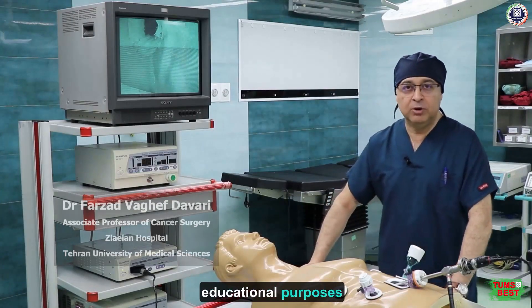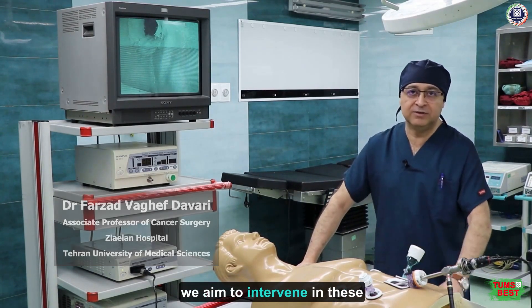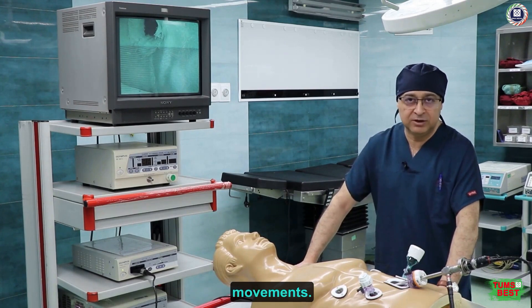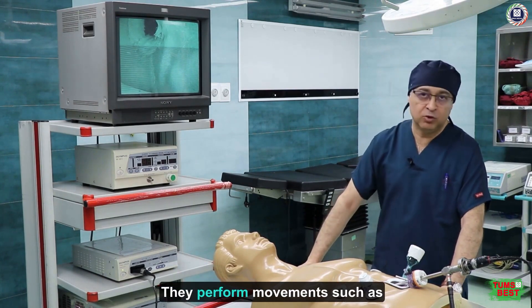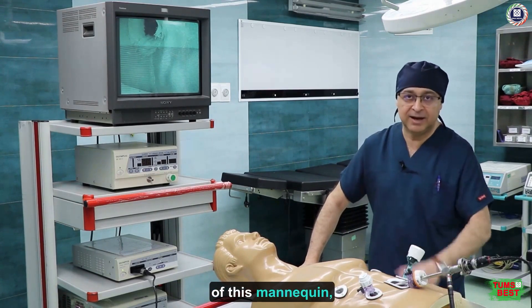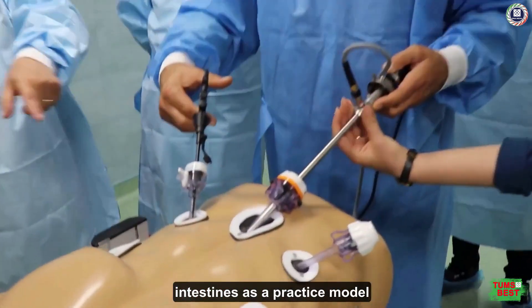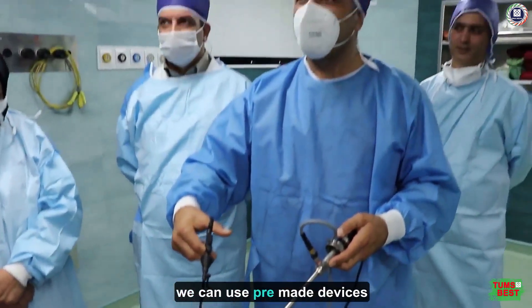This device is used for educational purposes for surgeons, surgical residents, and specialists. We aim to serve these three groups. In the first part, we utilize specialists who are interested in practicing laparoscopic movements. Connecting it to this monitor and our system, they perform movements such as repositioning certain components within the body cavity of this mannequin, which serves as practice. Sometimes surgeons test suturing techniques — for example, they can work with animal intestines as a practice model.